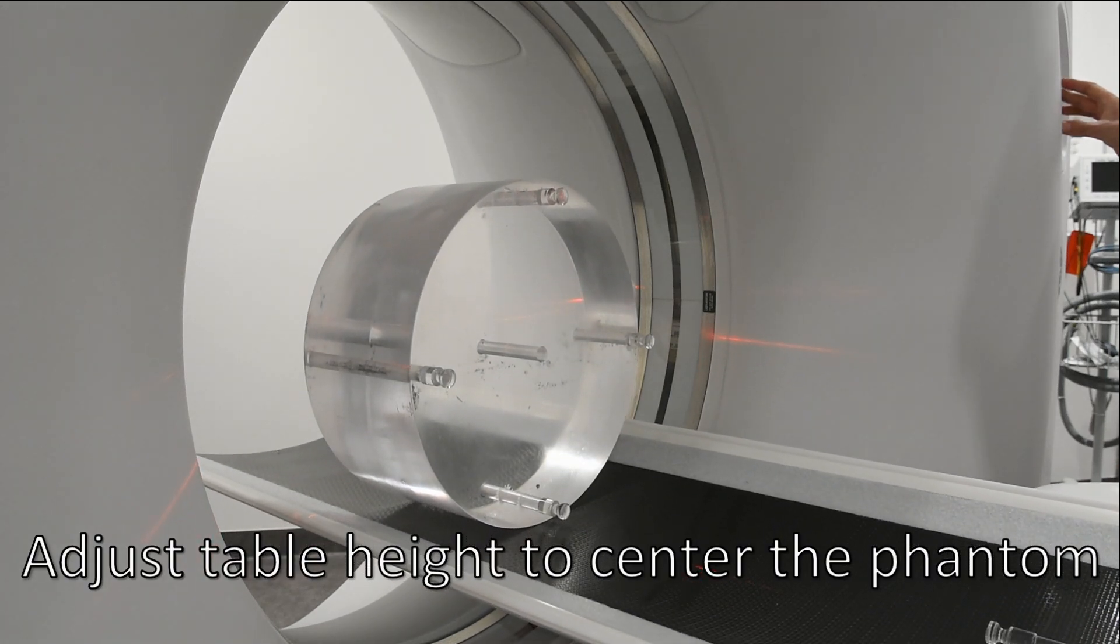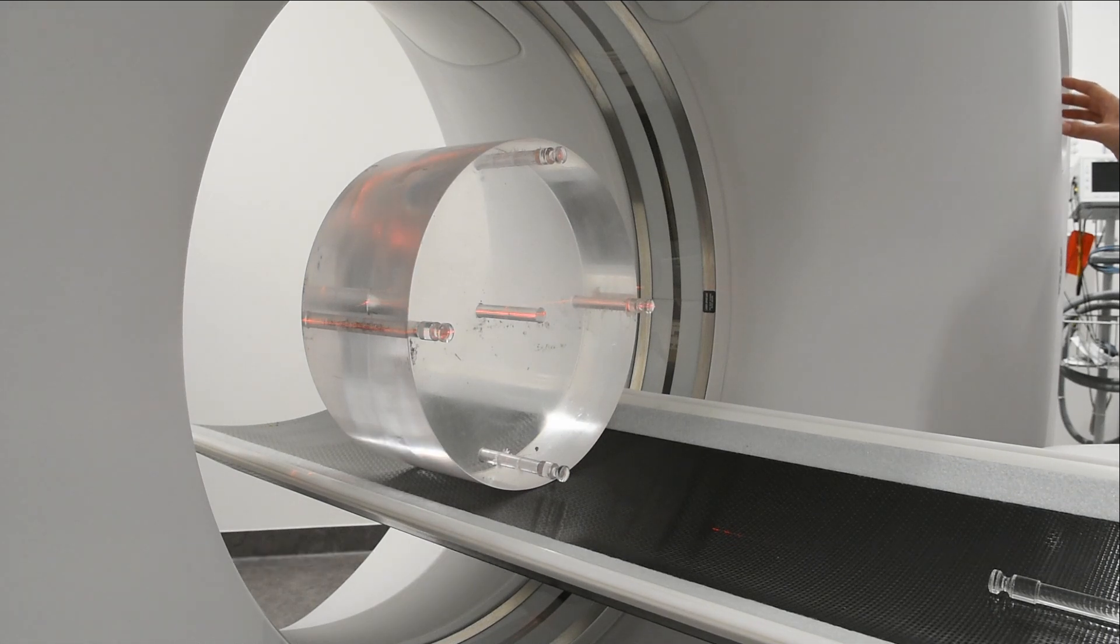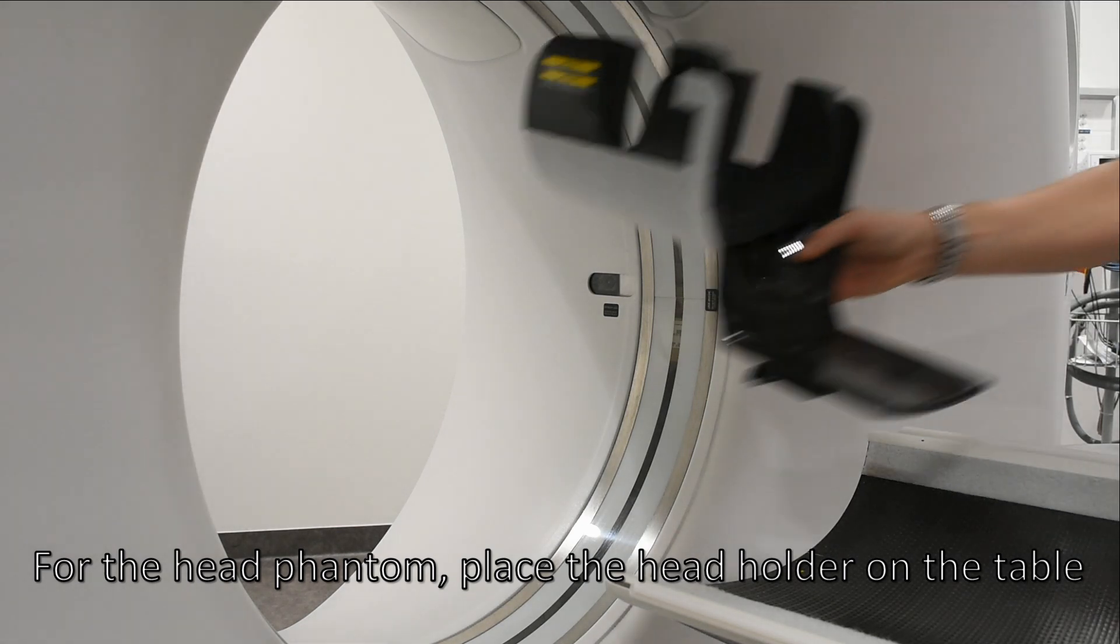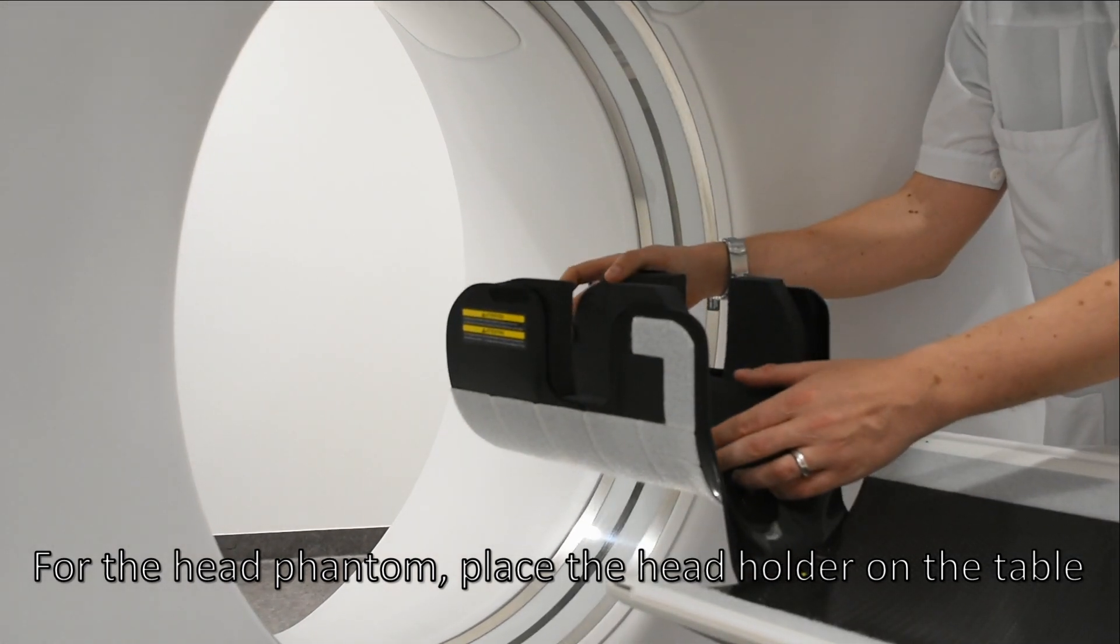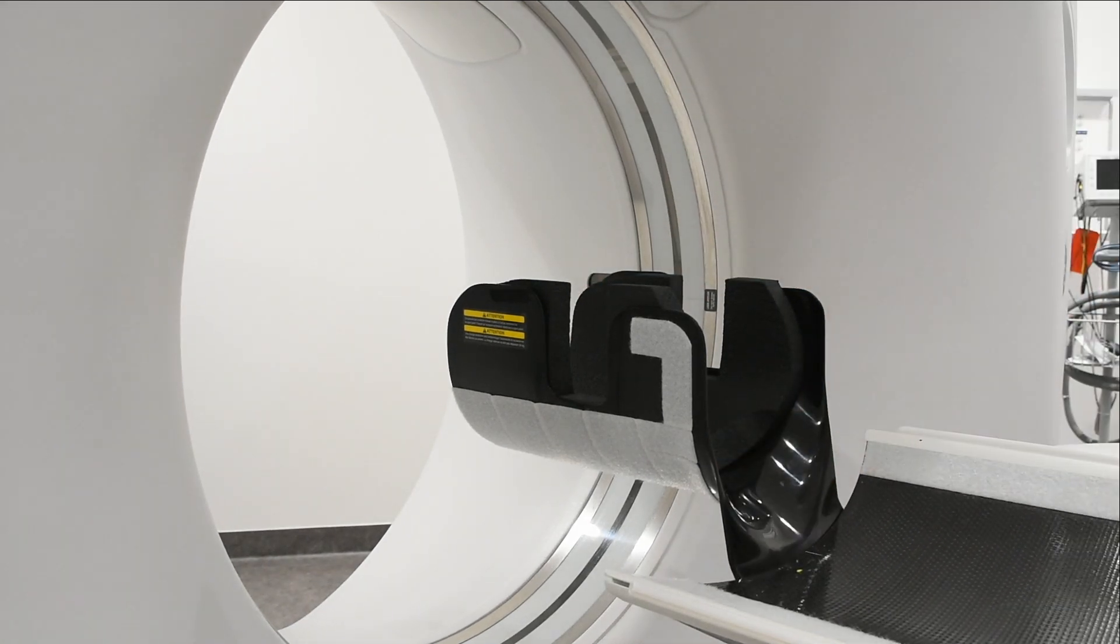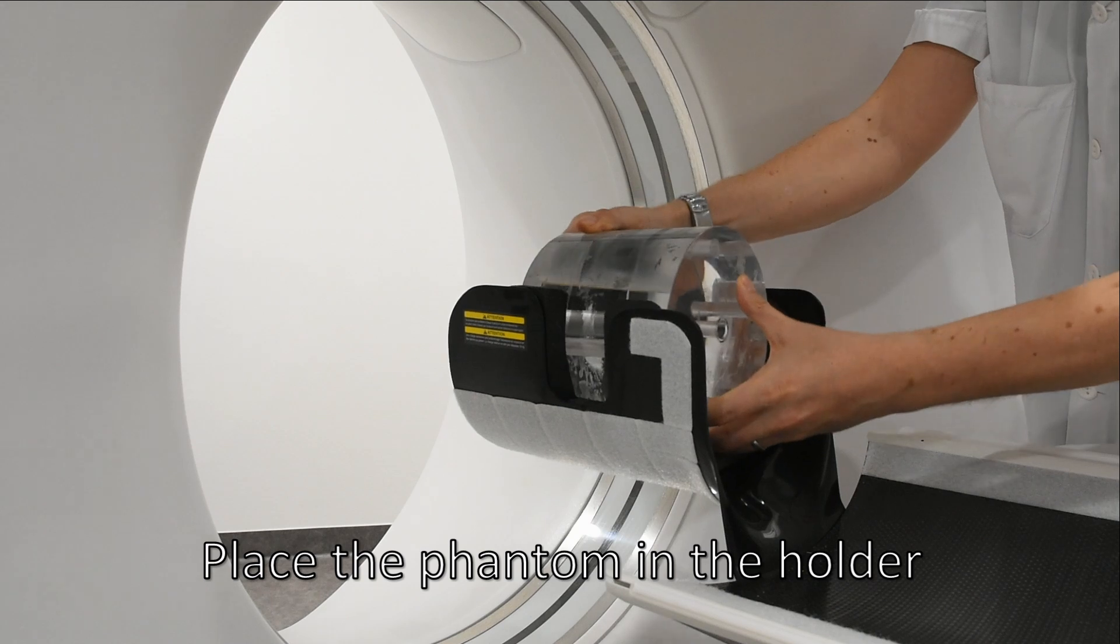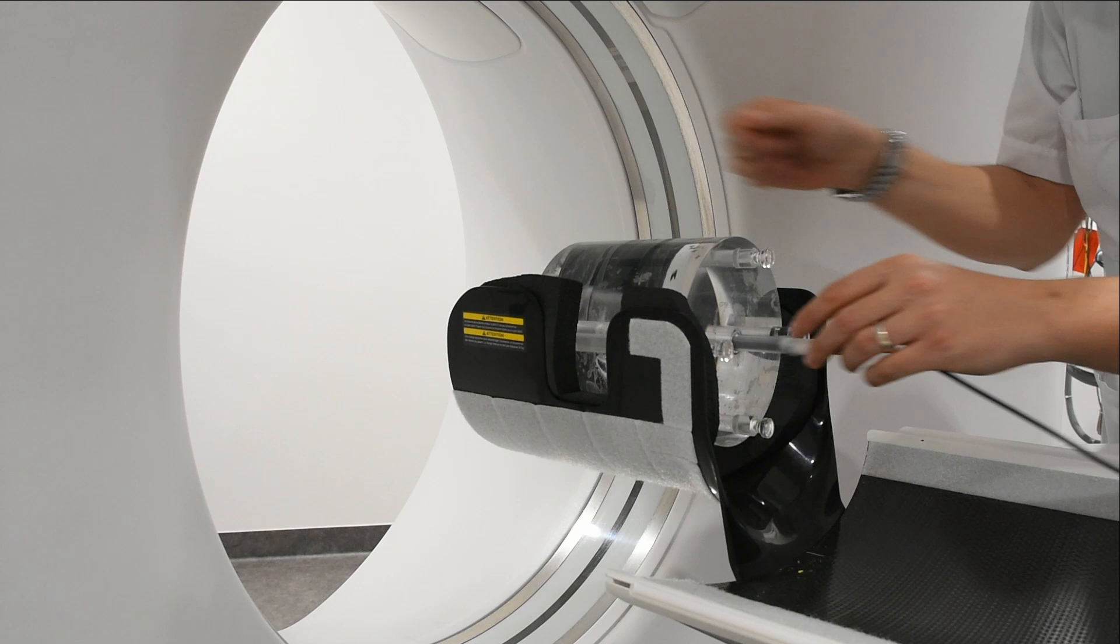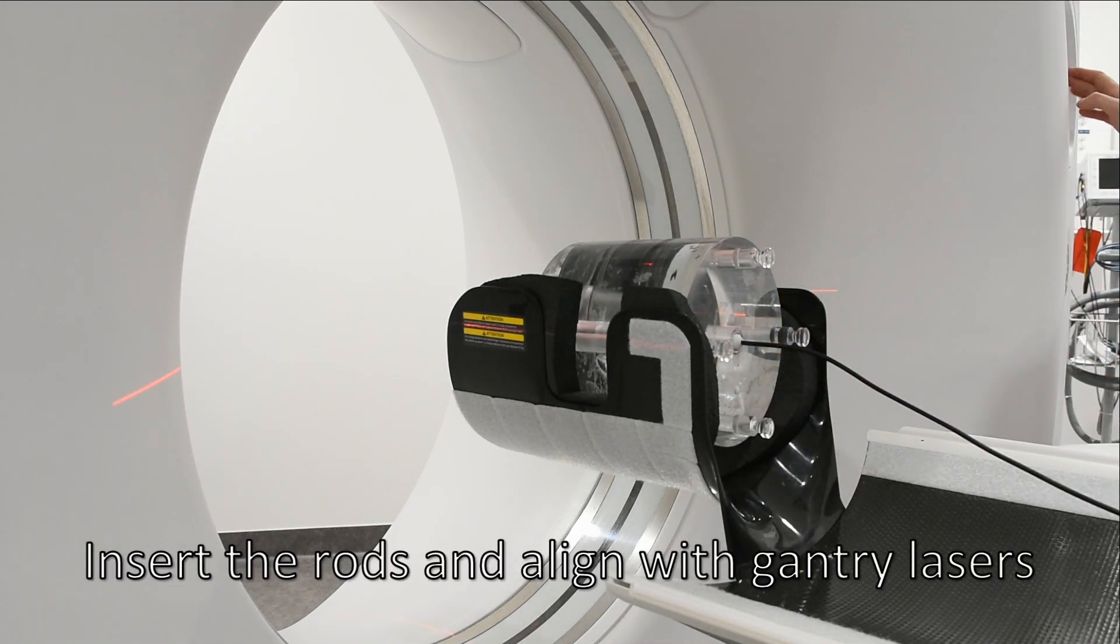Adjust the table height to center the phantom. For the head phantom, place the head holder on the table. Place the phantom in the holder. Insert the rods and align with gantry lasers.